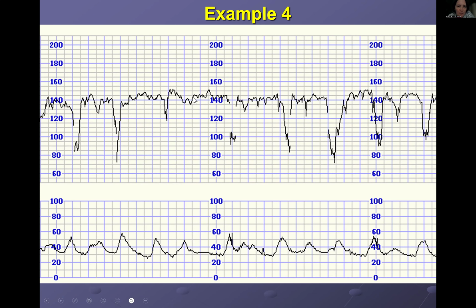What about the variability? If we look at the variability, are you happy with it? I think variability is okay. All right. The best way is to find a place where you've determined your baseline rate, which is around here, and you see the wiggliness of it.